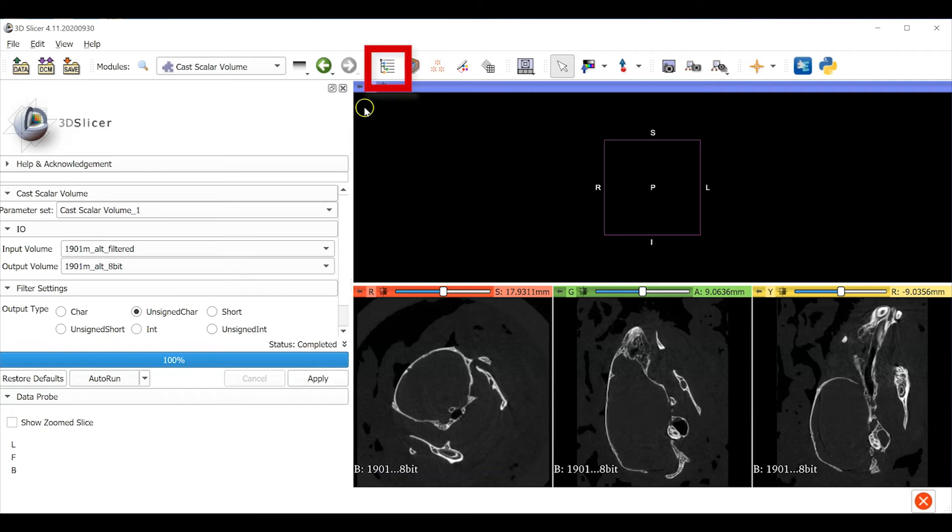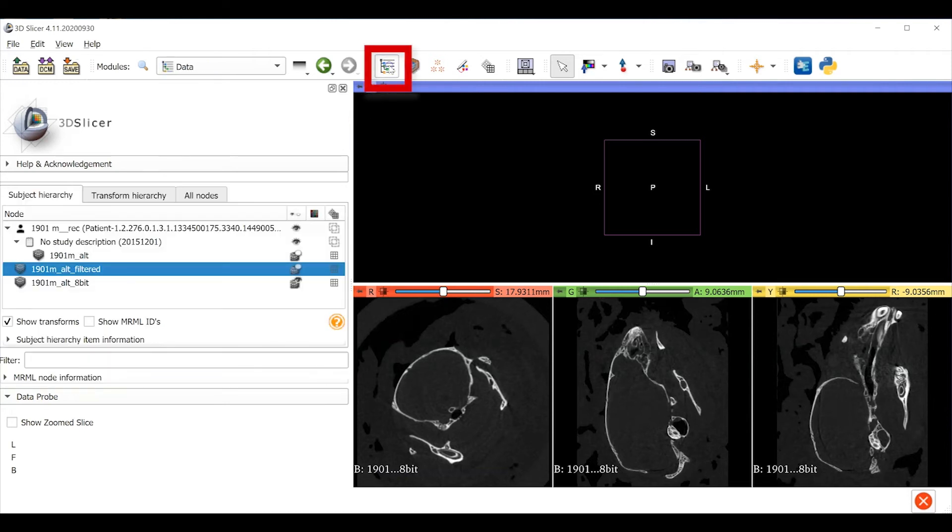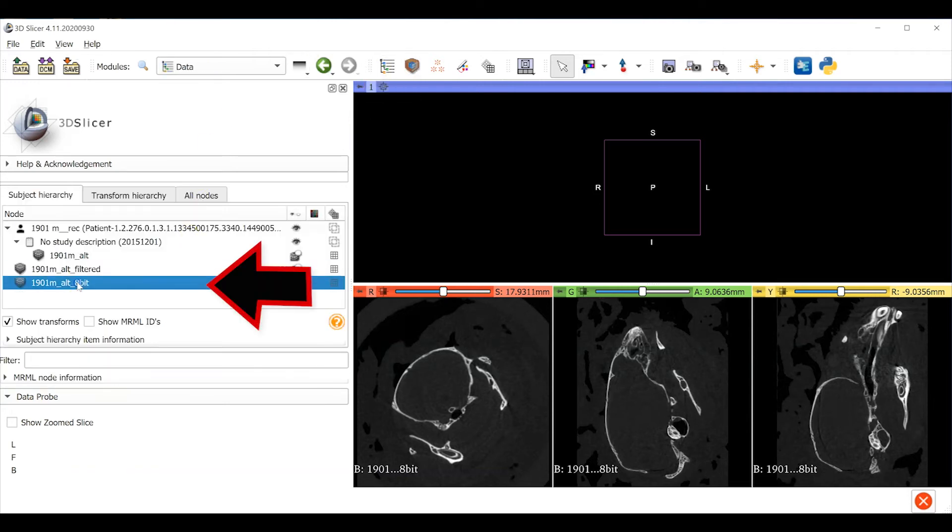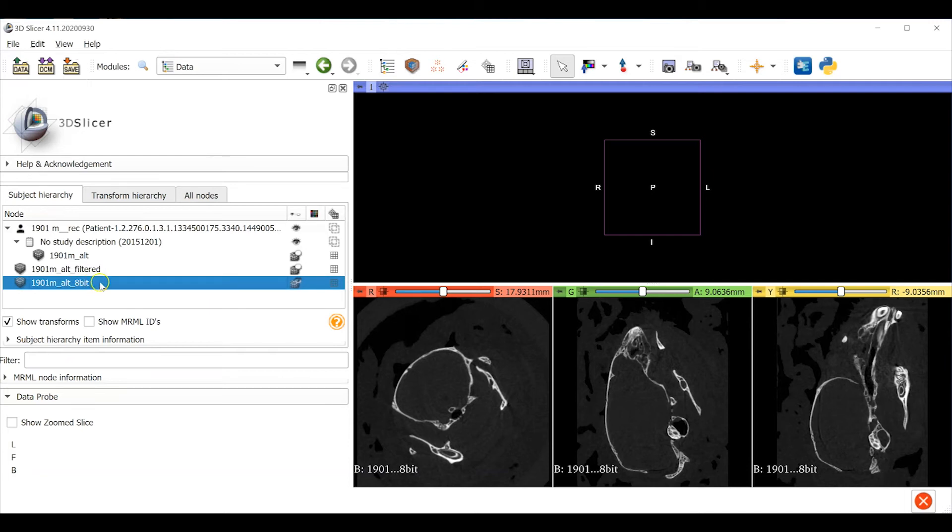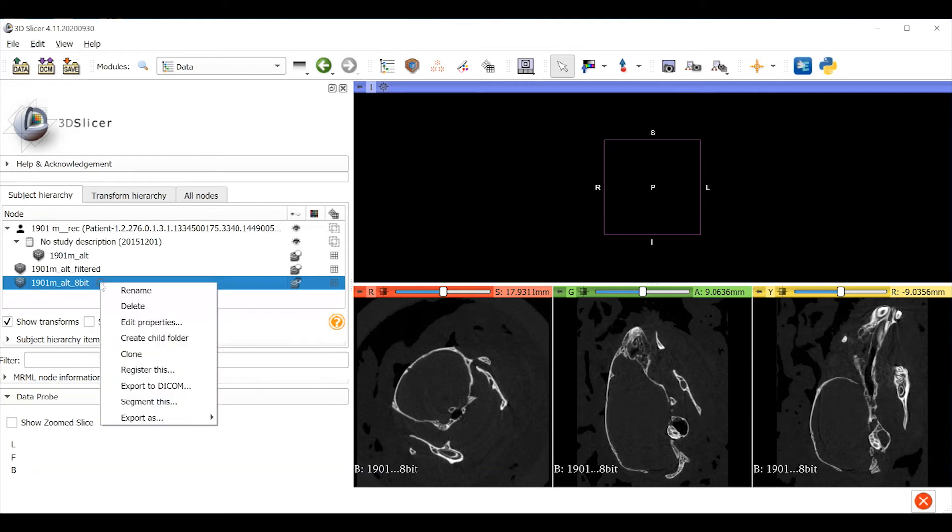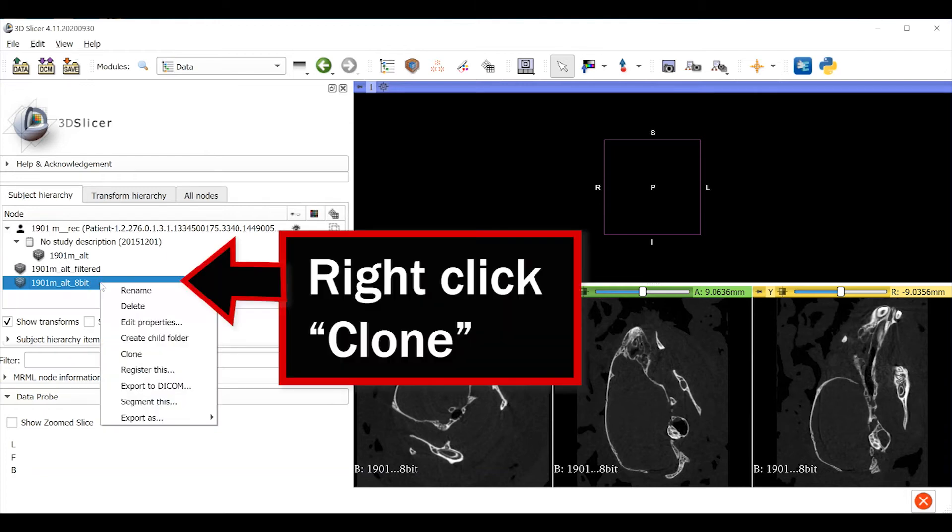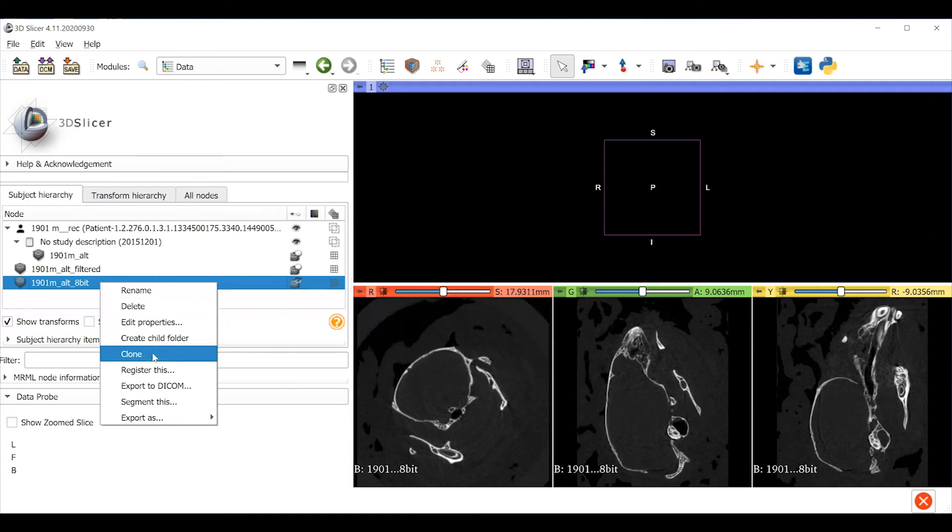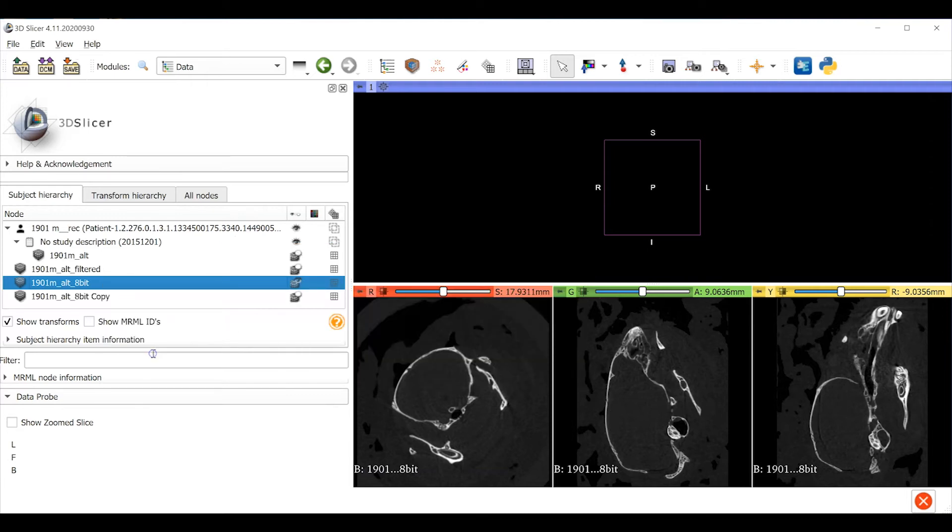Return to the data module. The 8-bit volume is the object that we're going to transform but before we can do that we want to make a copy that we're going to use as a template later. In the data module right click on the 8-bit object and select clone. We'll just let that copy sit there until we need it later.